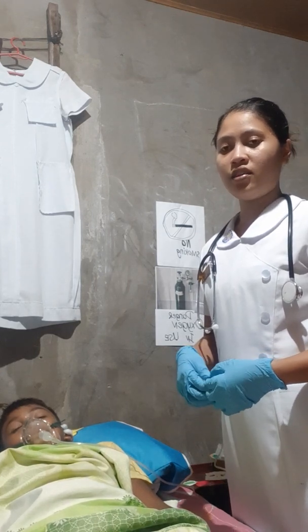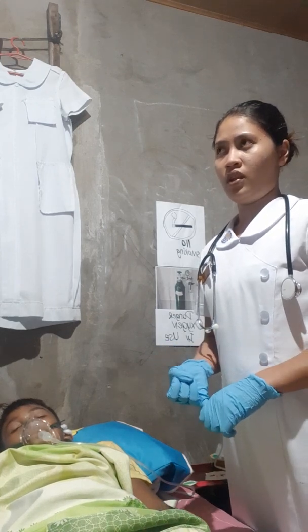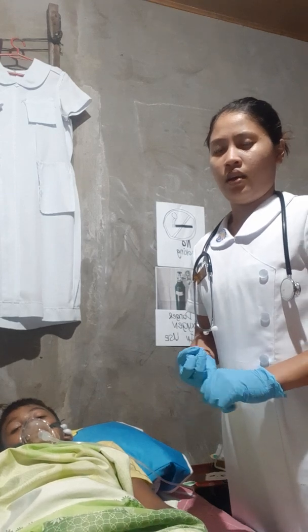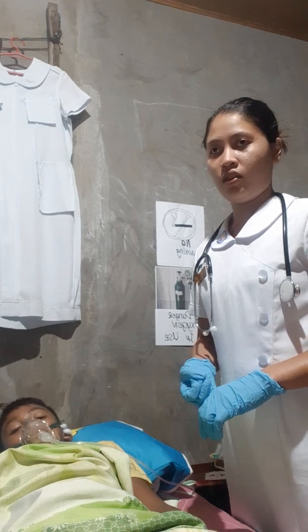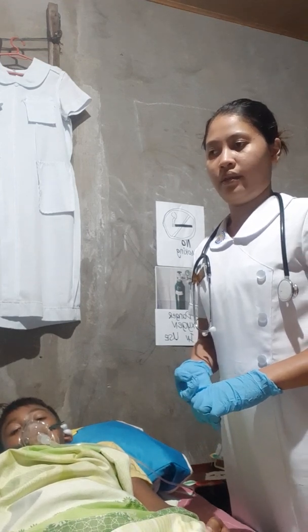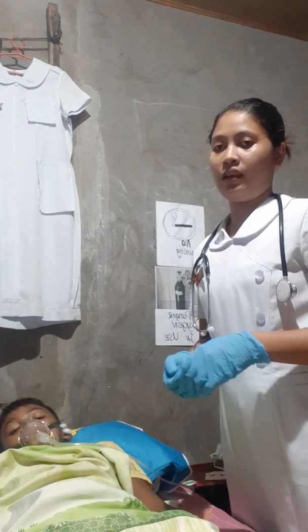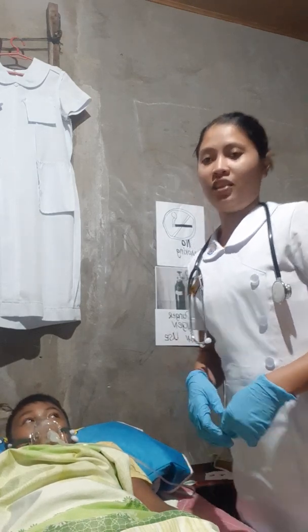Then, in the nursing shift report, include the following: the oxygen therapy, respiratory assessment findings, oxygen therapy method, flow rate, and client's response, adverse reaction, or any side effects we observed from the client from the beginning until the end of the procedure. That's all. Thank you.